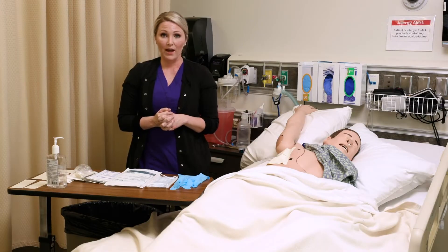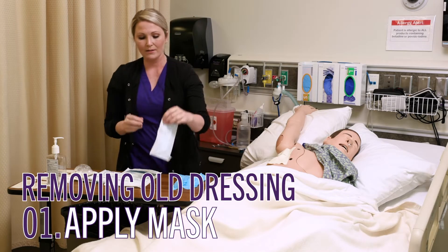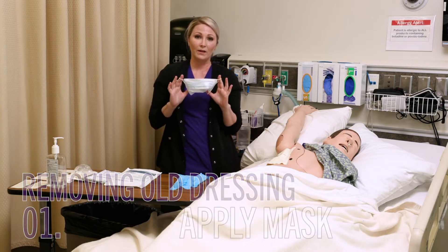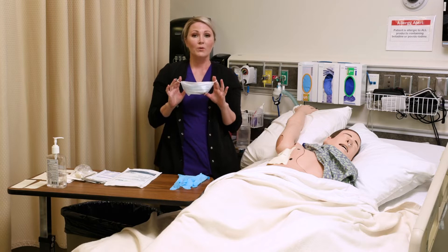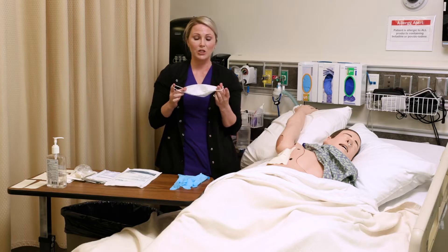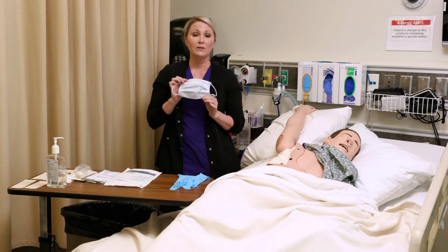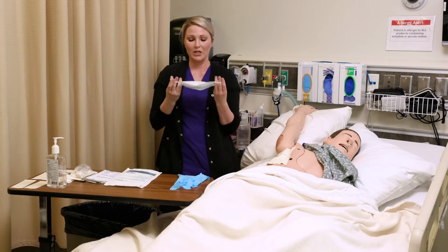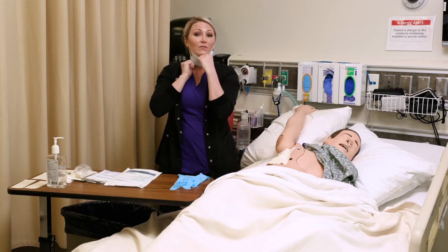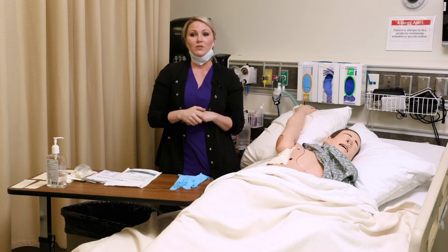Now I'm ready to go ahead and change my dressing. First I'm going to apply my mask. There is different research on the need to use a mask, but most sterile procedures are moving to using a mask, so that is how we're going to teach. The American Association of Critical Care Nursing does recommend wearing a mask for a chest tube dressing change. For purposes of this video I'm going to have my mask around my chin so that you can understand my instructions.